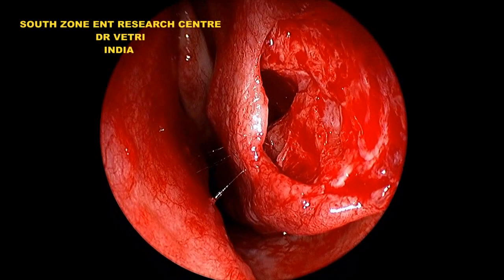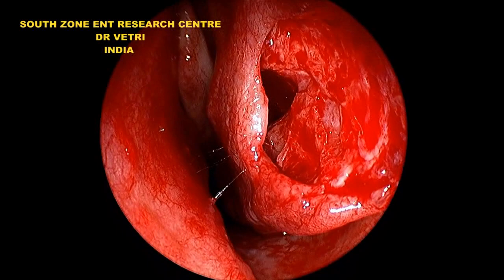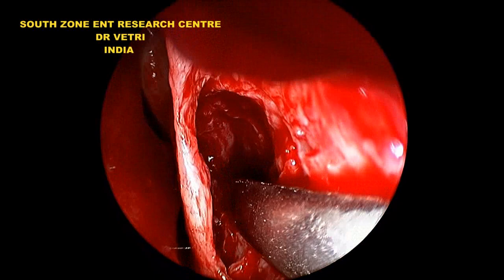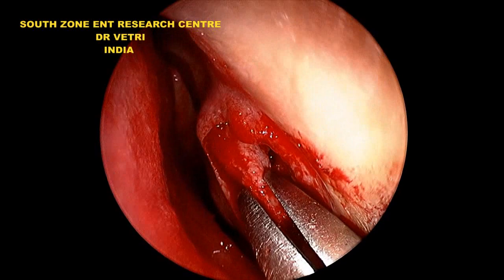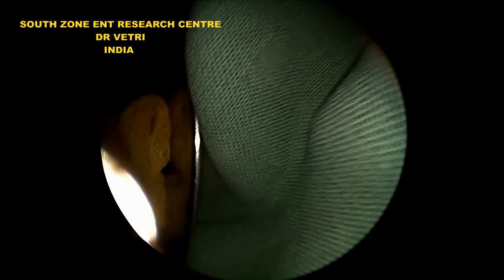Be careful not to injure the medial wall mucosa of the inferior turbinate. You can now see the anterior part of the inferior turbinate bone, which is dissected and beautifully removed. Be careful not to injure the lateral wall of the nasal cavity. See how comfortable the patient is.